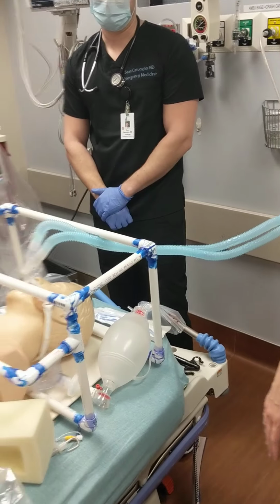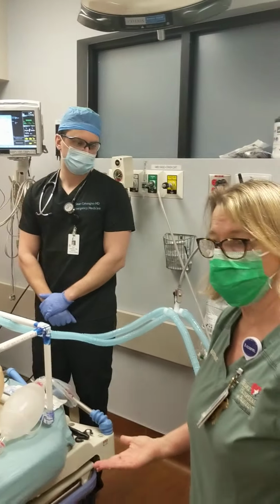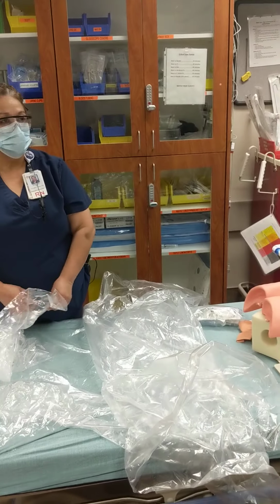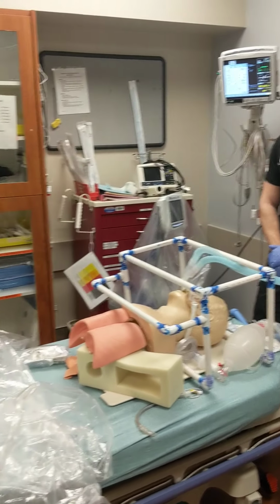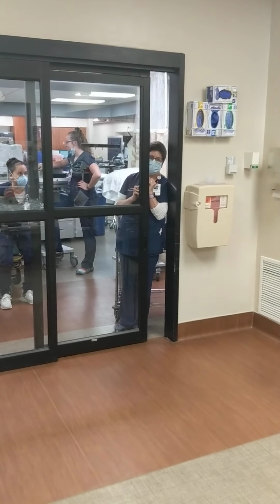We're in a closed system. We're ventilating our patient, and we've had less exposure. It's doable with the three people here. There will be a documenting nurse outside and people with extra hands in case we need them. Cool.